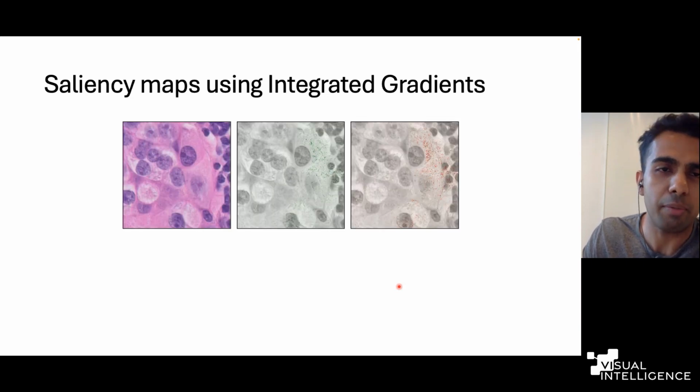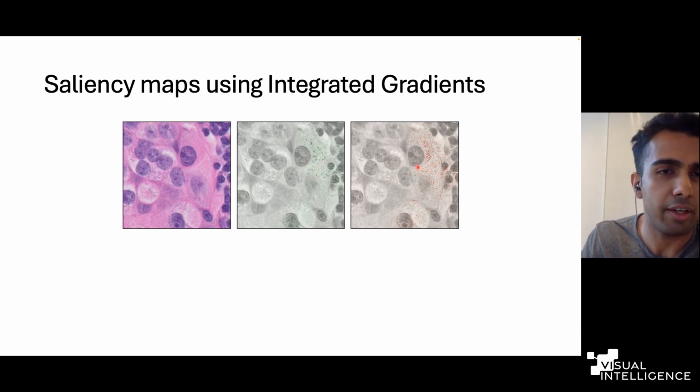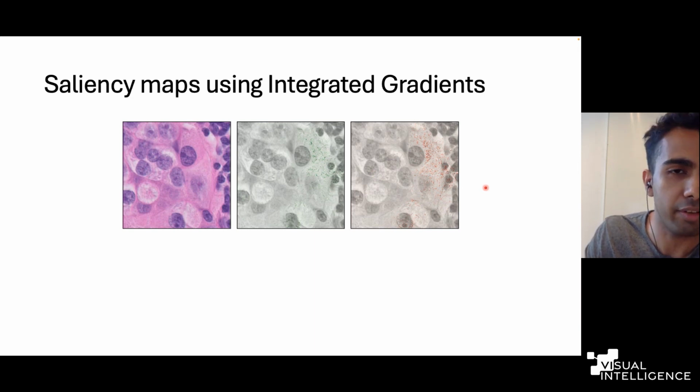If you look at a baseline method, ERM, for this image, this is the contribution from the positive class and this is the contribution towards the negative class. Green is positive, red is negative. But it's looking everywhere, and this is what you would expect. And I'm not cherry picking the image here. I looked at a few hundred images, and they all looked more or less like this.